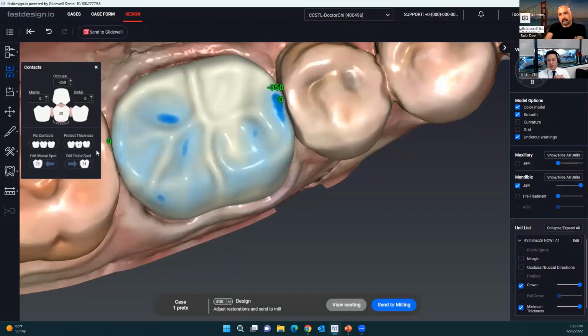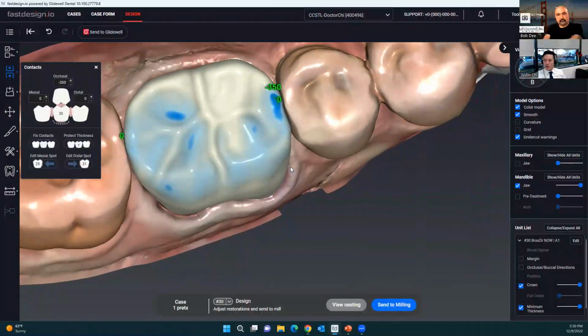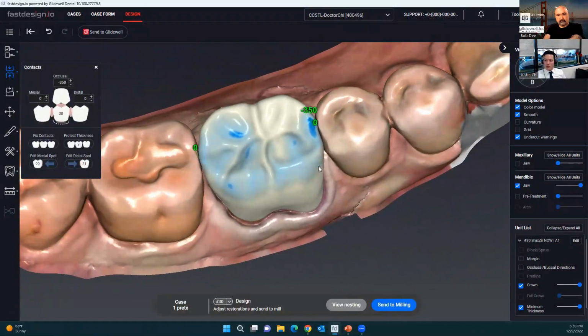No, we're actually compensating for the machining of this restoration and also taking into account the dynamic movement and compression of the teeth. This is just after several restorations and in testing that we've identified these values allow for minimal, if not no, adjustments once the restoration is milled out. And that is what I know most of you, I'm sure, are hoping for with your restorations, whether it's from the lab or, of course, chairside.